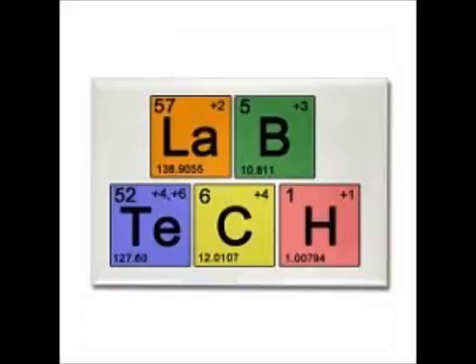Anyway, in micro, I have to teach you a thing called biochemicals. Sometimes you'll go to the micro department and you'll know your biochemicals better than the techs, because they see if it's gram positive, gram negative, get the gram positive card, put it on the Vitek. Gram negative card, put it on the Vitek. And I have to teach you all the biochemicals because on the BOC you have to know them.